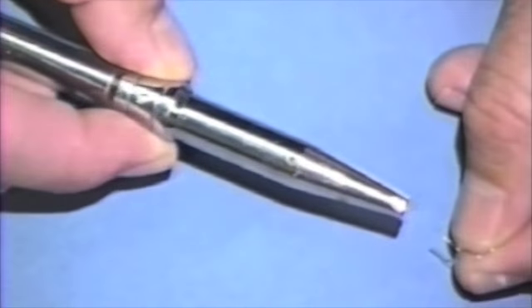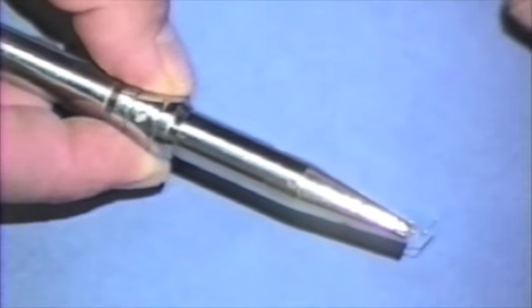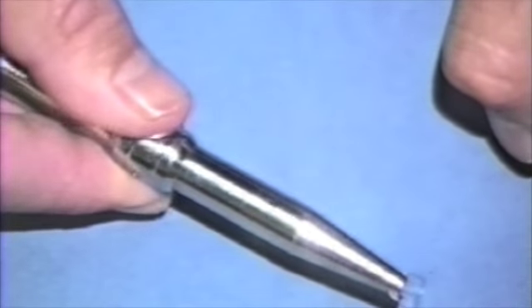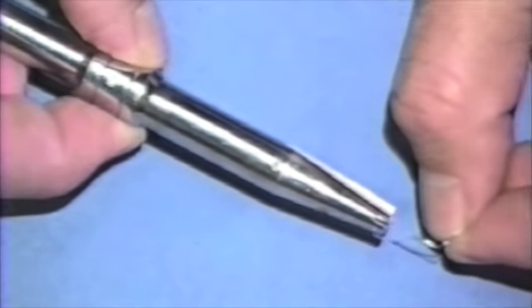Some of you may find the ligature tie techniques easier when using the Twistmate ligature placer. There are preformed short ligatures that are fed into the locking mechanism by pulling back on the lever and releasing.